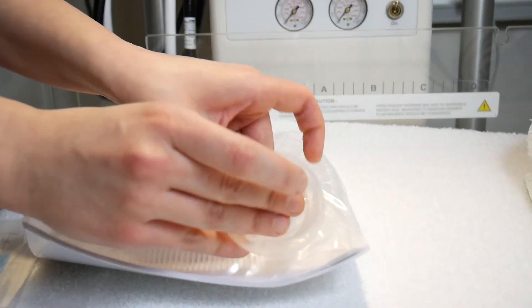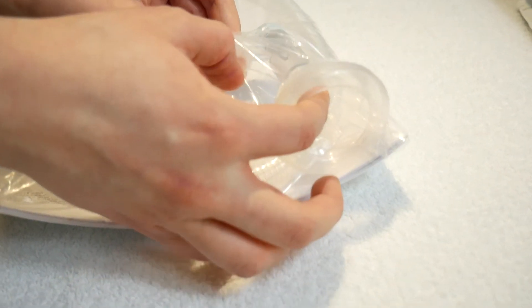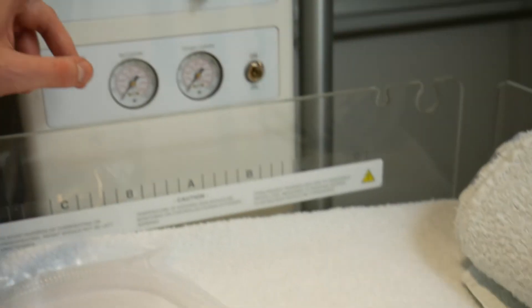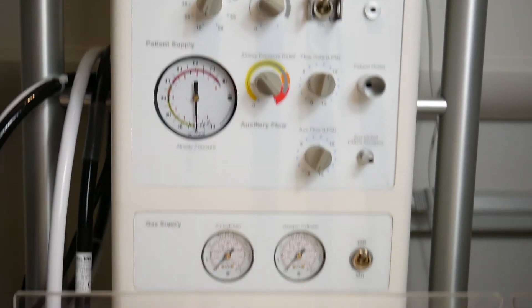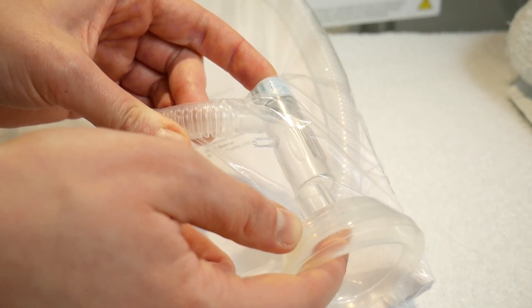Once the T-piece is connected to the gas outlet, you can test your pressures. First by occluding the valve inside the mask, the needle will move to your desired level of PEEP. To check your peak inspiratory pressure, occlude the valve at the top of the T-piece.